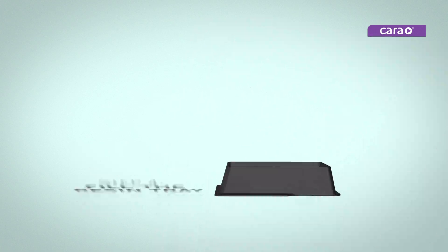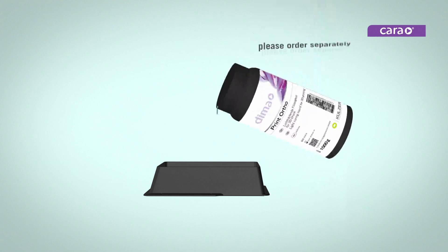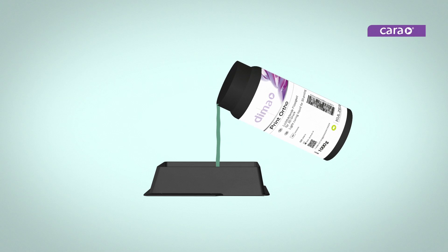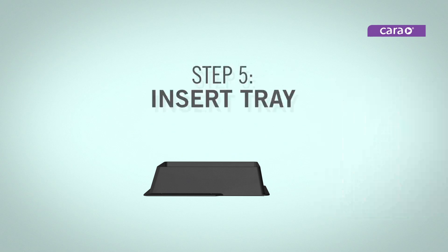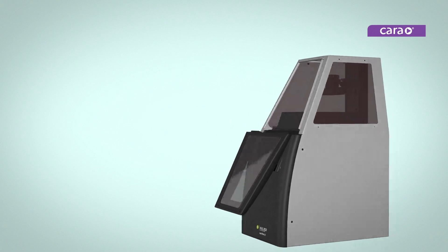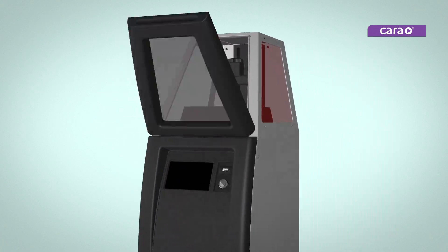Select one of the included CaraPrint trays and fill it with a resin such as dima Print Ortho. A max fill line is provided to help prevent overfilling. Be sure to wipe off any excess resin from the side of the bottle before reclosing it for storage. Insert the tray into the slots at the bottom of the printing area until you hear an audible click and see a solid green line.